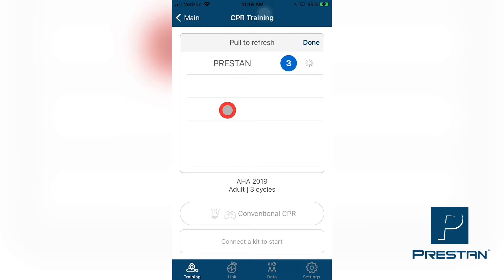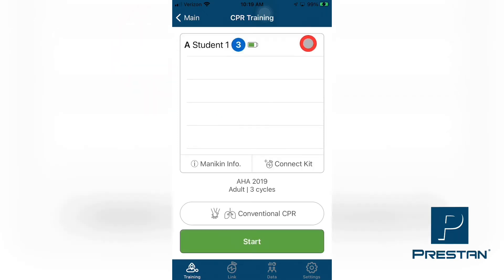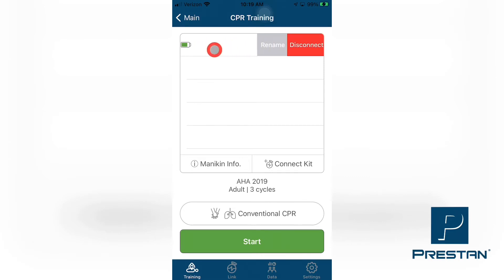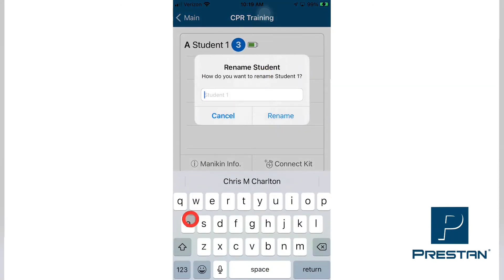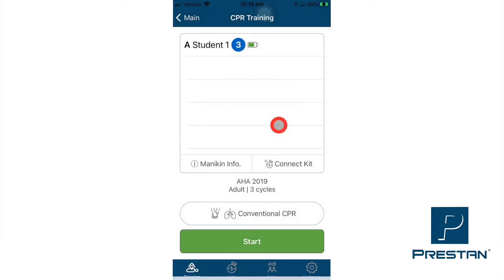Once connected, a checkmark will appear on the line with the mannequin name. When all mannequins have been connected, press Done at the top right corner of the screen. Next, press and hold the name of the mannequin that is to be renamed. While still pressing on the name, slide your finger to the left until you see two buttons appear. Note that if you continue to slide your finger to the left, the Rename button will disappear and only the Disconnect button will show. Select Rename. Type the new name with the keyboard that appears in the app. When complete, press Rename. This new name will now appear on the list of mannequins. Please repeat this process for each mannequin that you wish to rename.